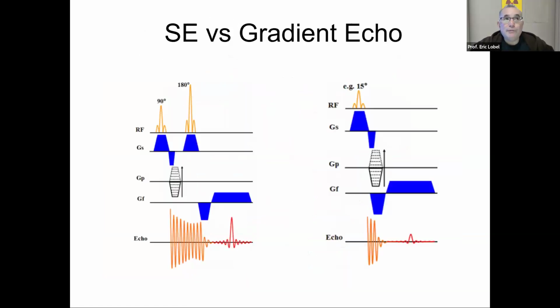Pulse sequence diagrams are just that. They're diagrams that represent timings of different events that the computer knows, but we're trying to graphically represent that. So it's kind of like asking like 3 or 4 people to draw a map, right? They're going to have the same kind of things, but they're not always drawn exactly the same. Right. So we're gonna see that.